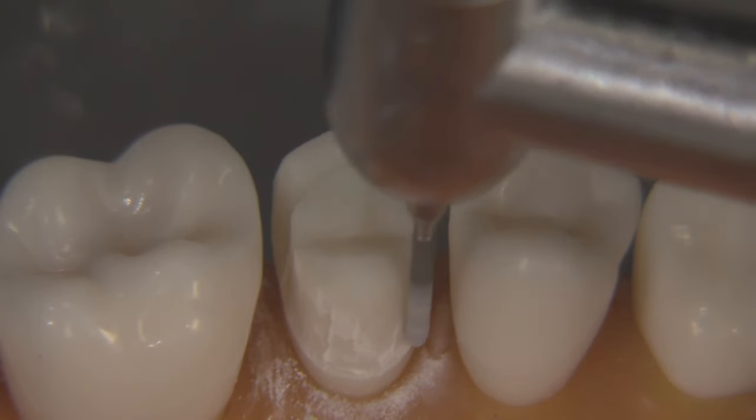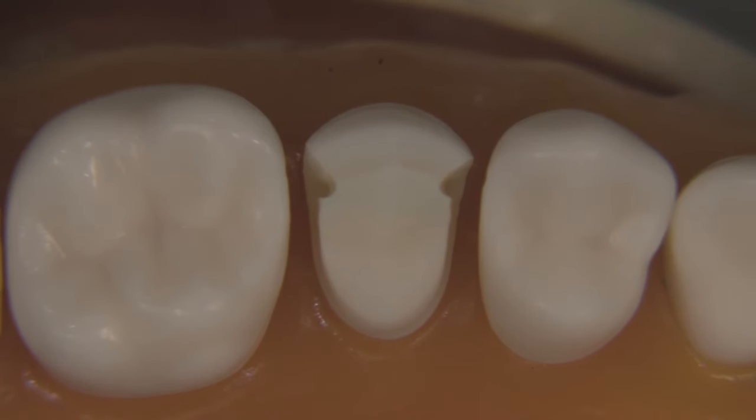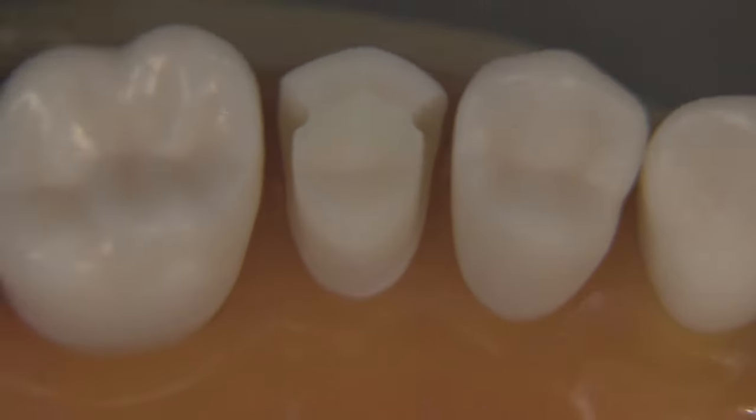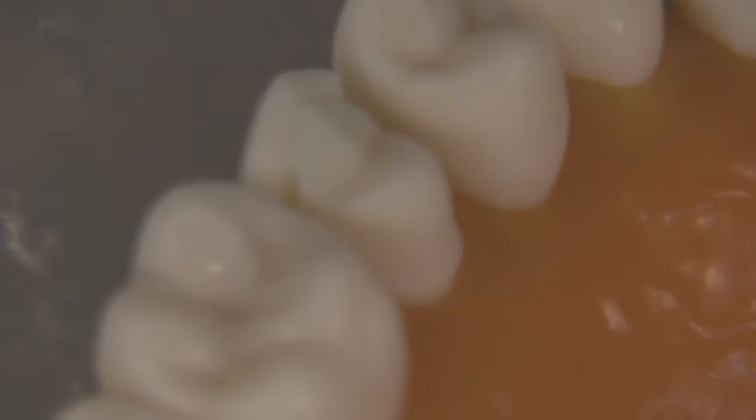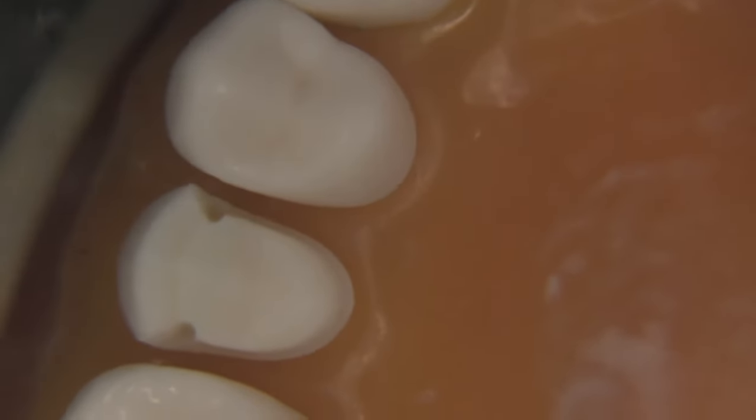Let's take a look at what happens when we evaluate the preparation from the occlusal: everything looks like it's in pretty good shape, the draw is adequate, the offset is nice and uniform with a definite form you can see very easily, and there's the little contra-bevel off to the facial. How does this look in occlusion? Taking the typodont and closing it together — it actually looks like a tooth. We want 1.5 millimeters on the lingual, and about 0.75 to 1 millimeter of clearance on the facial. I've got an instrument called an RGS2 — 0.75 millimeters in diameter — and you can measure the clearance really easily with this instrument.